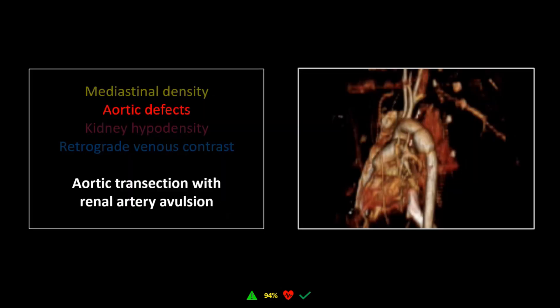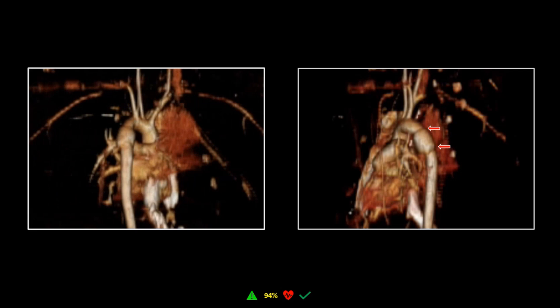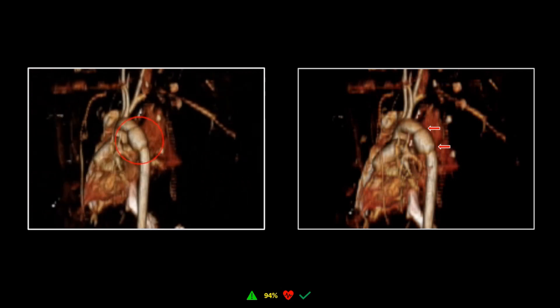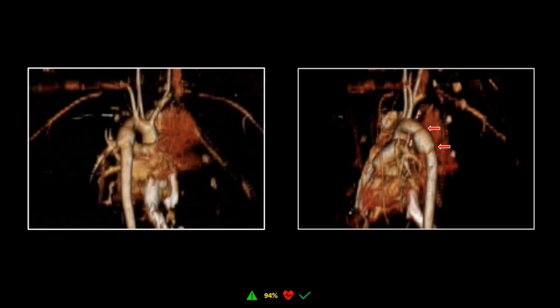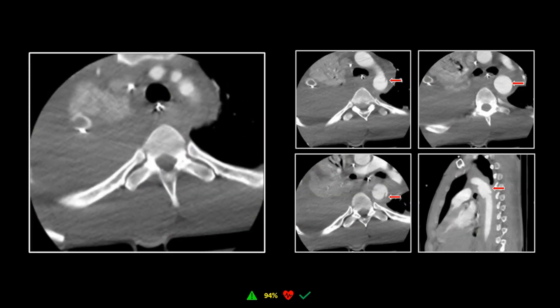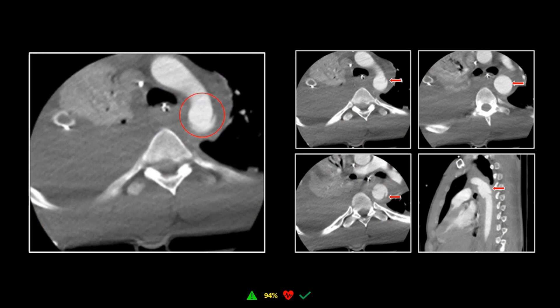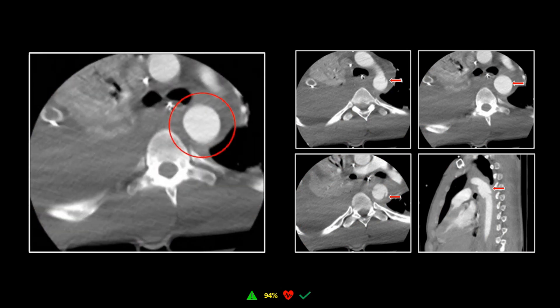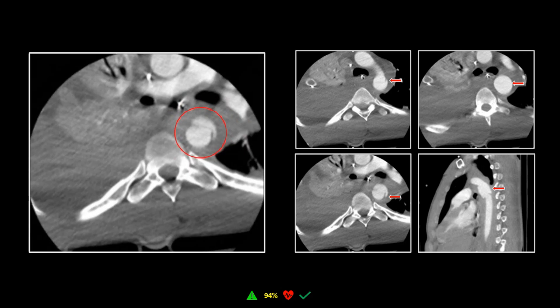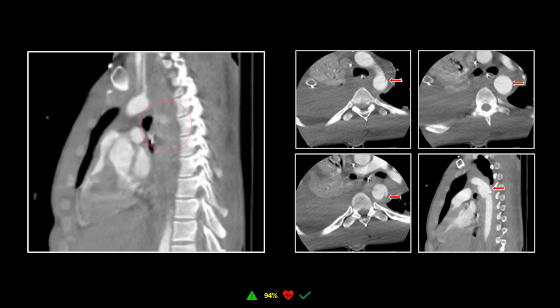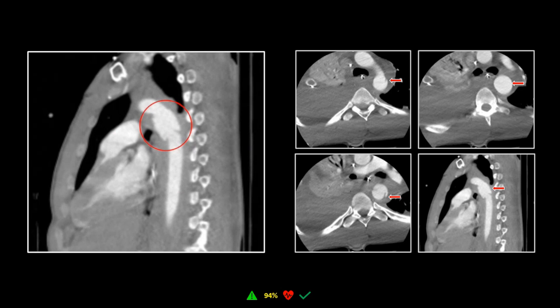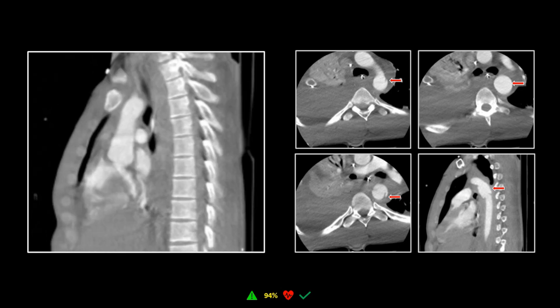I've got additional views here. Aortic transections make for beautiful 3Ds. There it is — it's one tear, the ends of the aorta have pulled apart, and you've got that intervening segment representing a pseudoaneurysm bound by adventitia. That 3D really makes clear what's going on. This patient also had a thoracic spine CT, so we have a magnified view, and there it is again, along with a sagittal as well. Now that you know what's happening, they're pretty easy to spot.